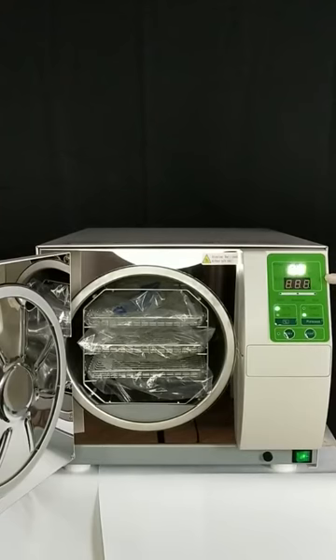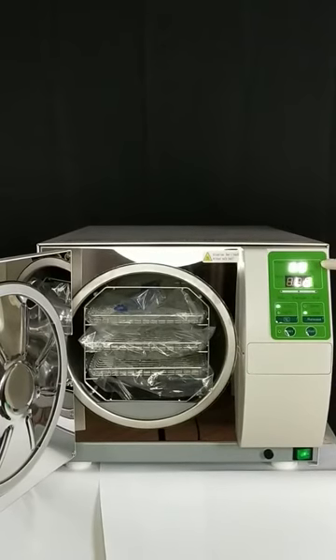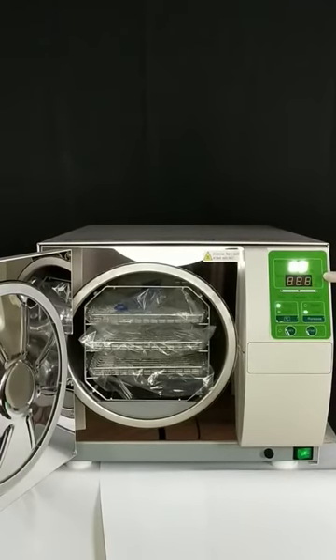pressure, and the cycle stages. The precisions are up to 0.1 Celsius degrees and a thousandth bar.